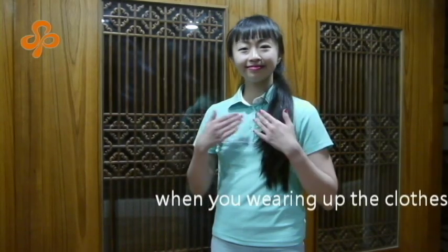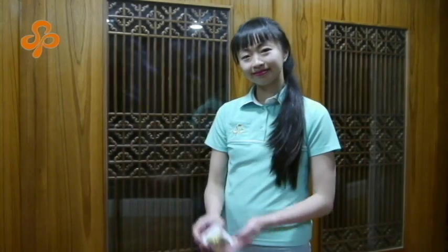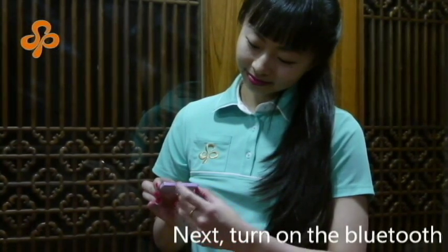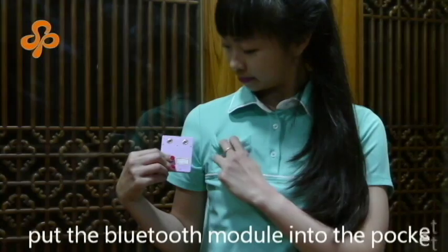When you are wearing the clothes, the sensor will automatically search your location. Turn on the Bluetooth, then put the Bluetooth module into the pocket.